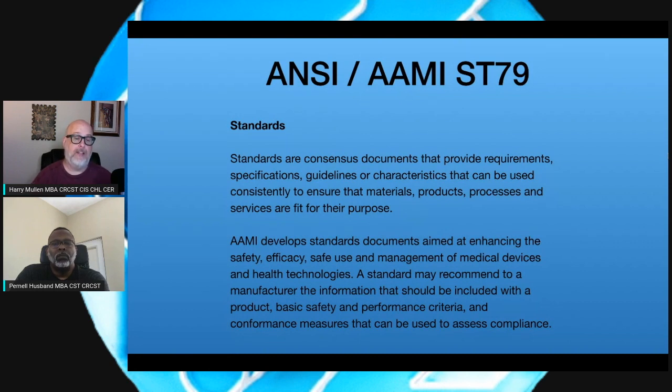And I love the fact that AAMI gives them those recommendations. Now, it's not mandatory that those vendors go ahead and give out that information in a certain manner. But since a lot of these vendors probably sit on the AAMI standards board, they're more apt to go ahead and follow those recommendations.